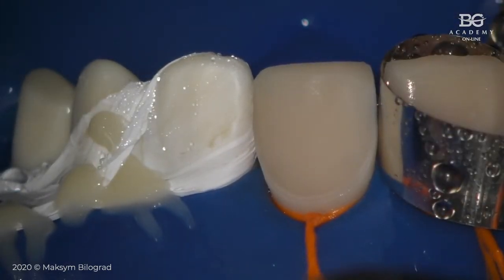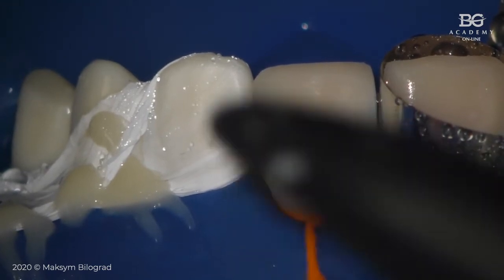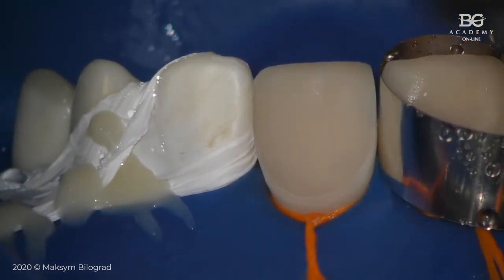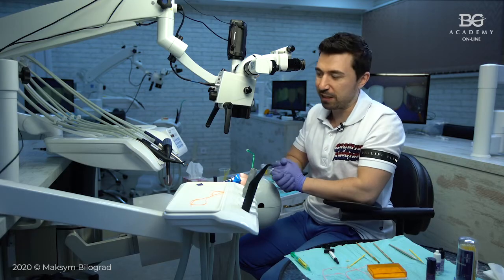Then we will apply bonding agent, okay? After rinsing, after drying, we apply bonding agent. So this is the easiest scenario and more predictable and more efficient in adhesive dentistry.